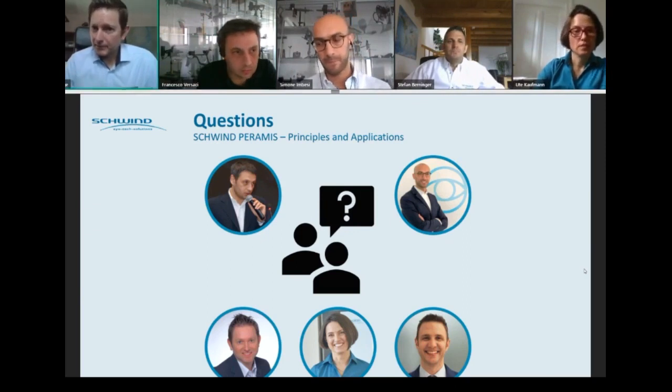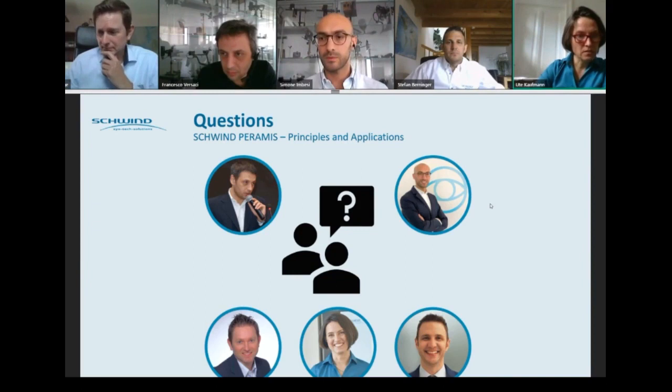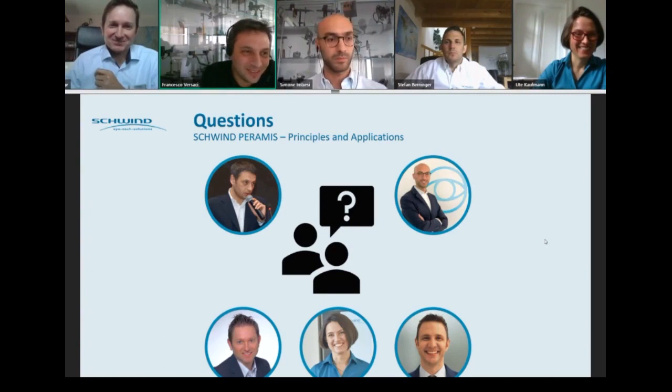Any other questions? So far, there are no other questions. Maybe the auditorium would like to ask even more. Right now, there was another question to IOL tilt. Is there a way to select specific aberrations to treat? Maybe you might be better to ask Ute, Stefan, or Jens. You are more adequate than me in answering.